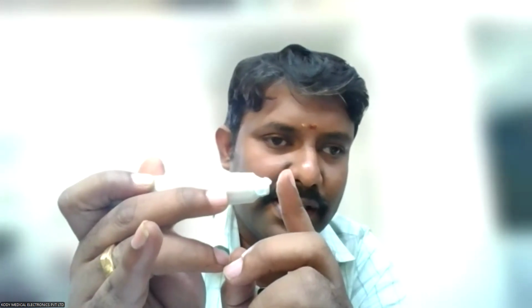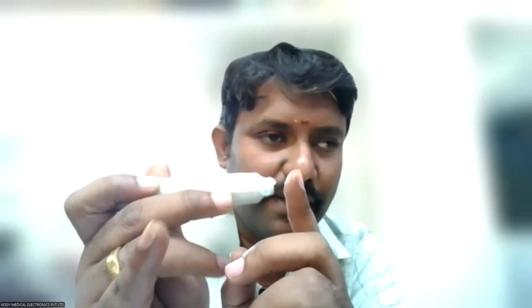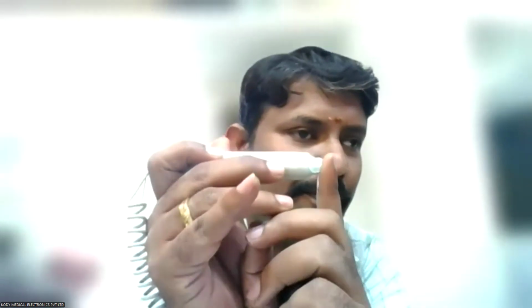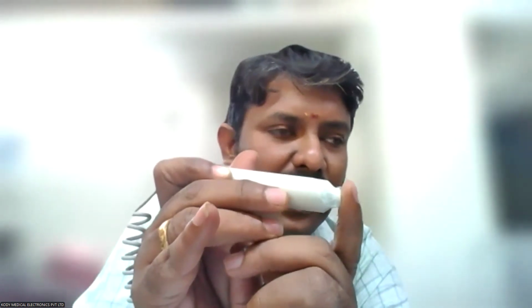If the artery lies beyond 1 centimeter, more than 10 mm, you need to give a little pressure on the skin to squeeze it and observe the flow. Even while squeezing, you should not occlude the artery.